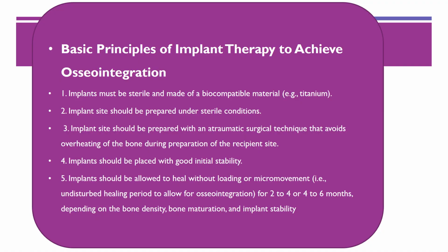Basic principles of implant therapy to achieve osseointegration. This is very important. We need to know what principles are needed for osseointegration, as osseointegration determines the success of implant placement. Implants must be sterile and made of a biocompatible material, for example titanium. Titanium is superior to other materials.